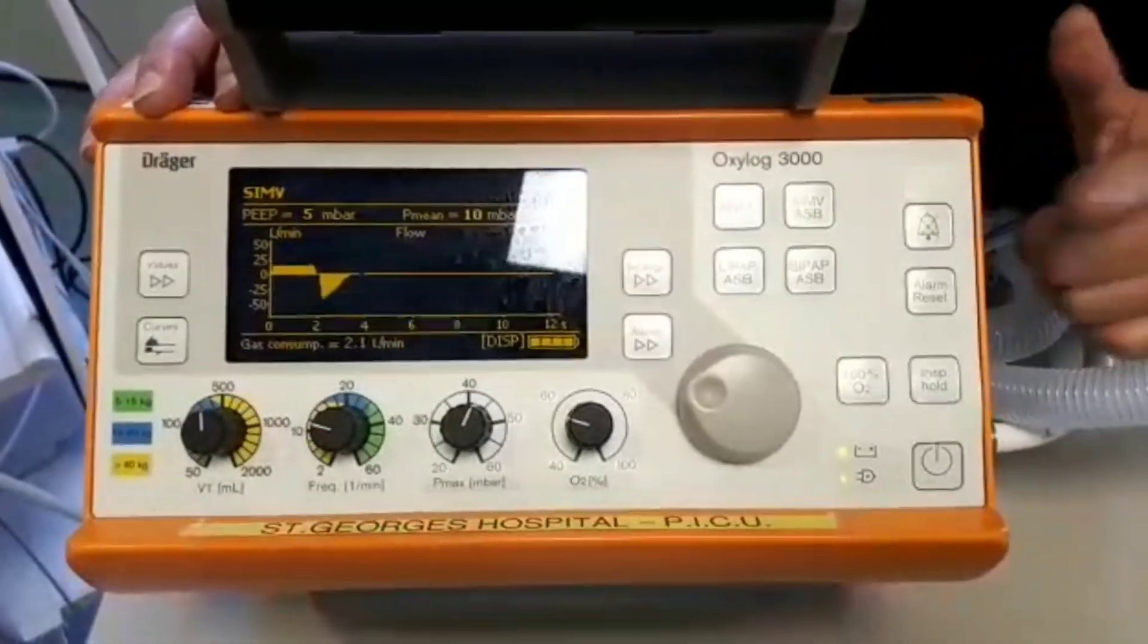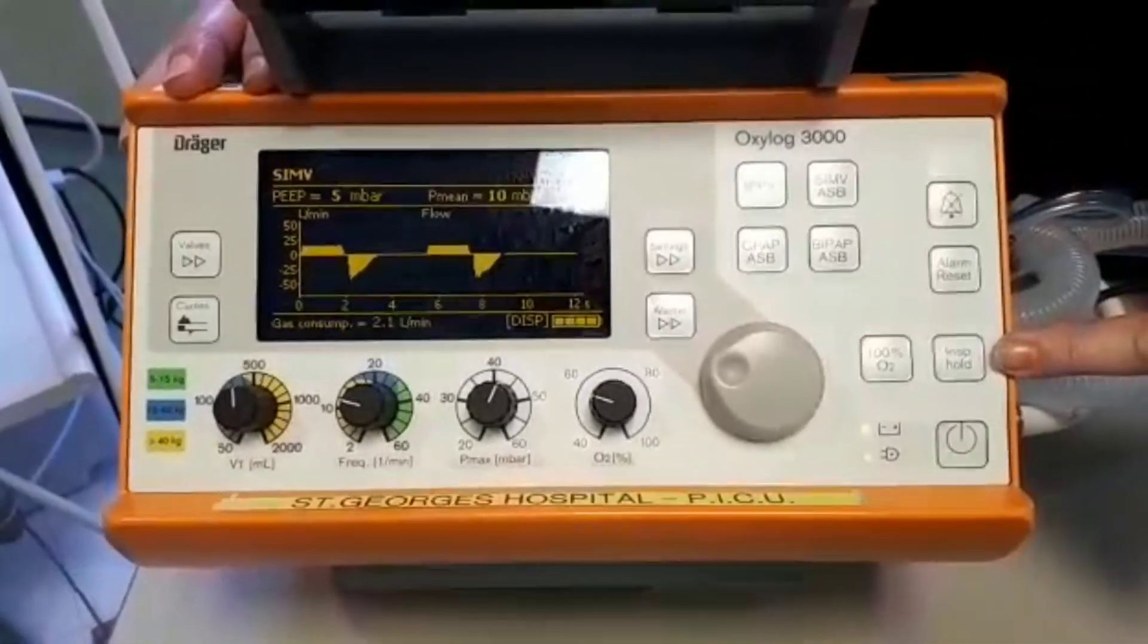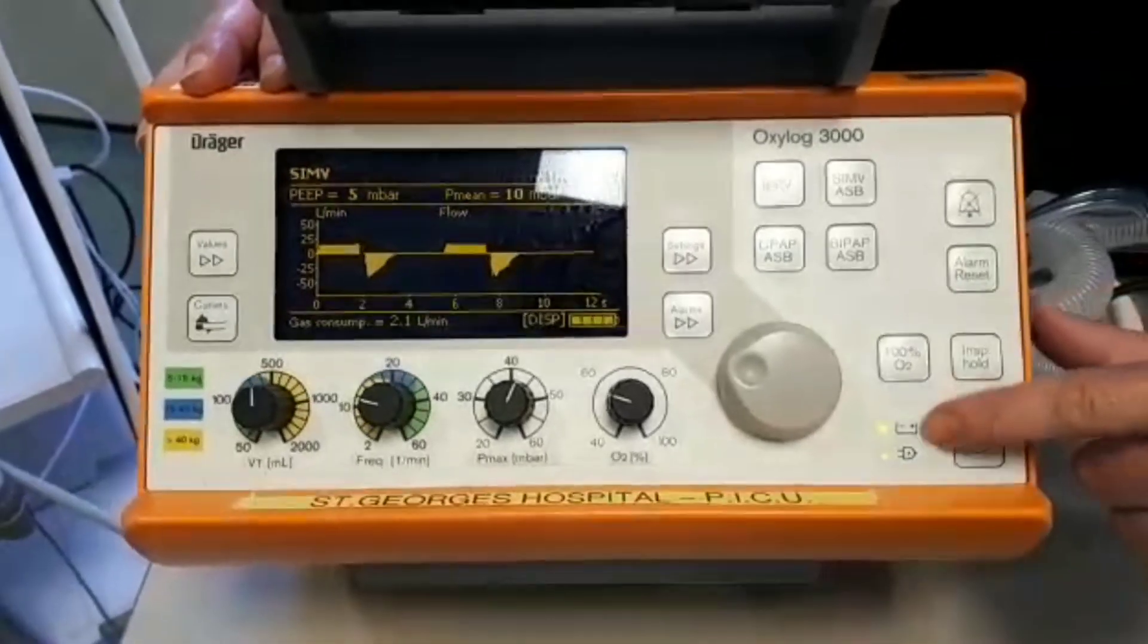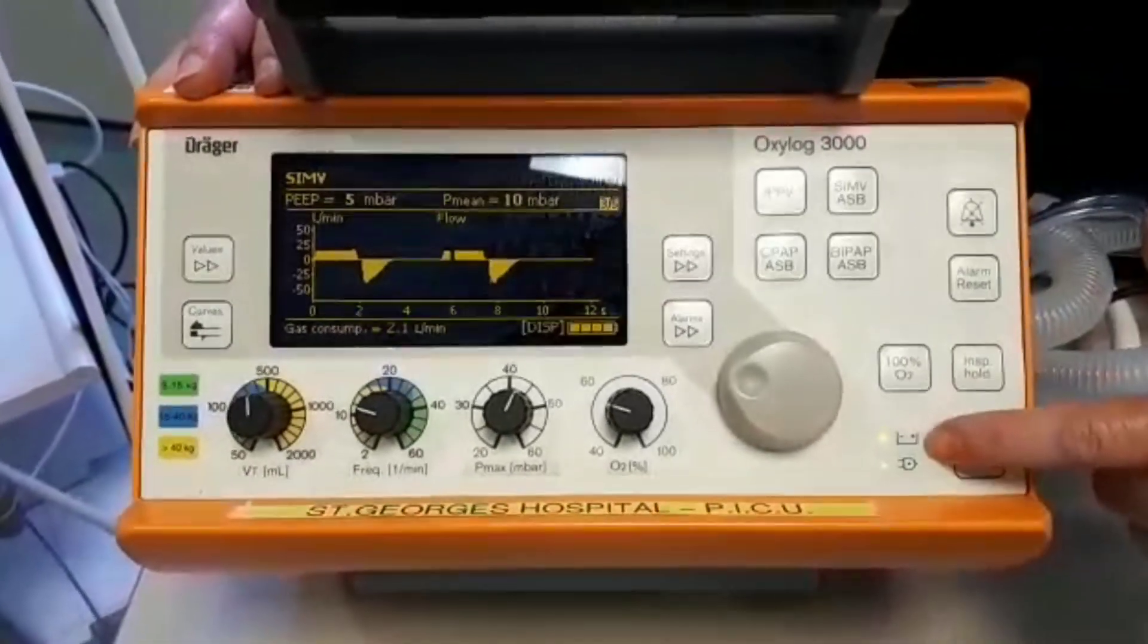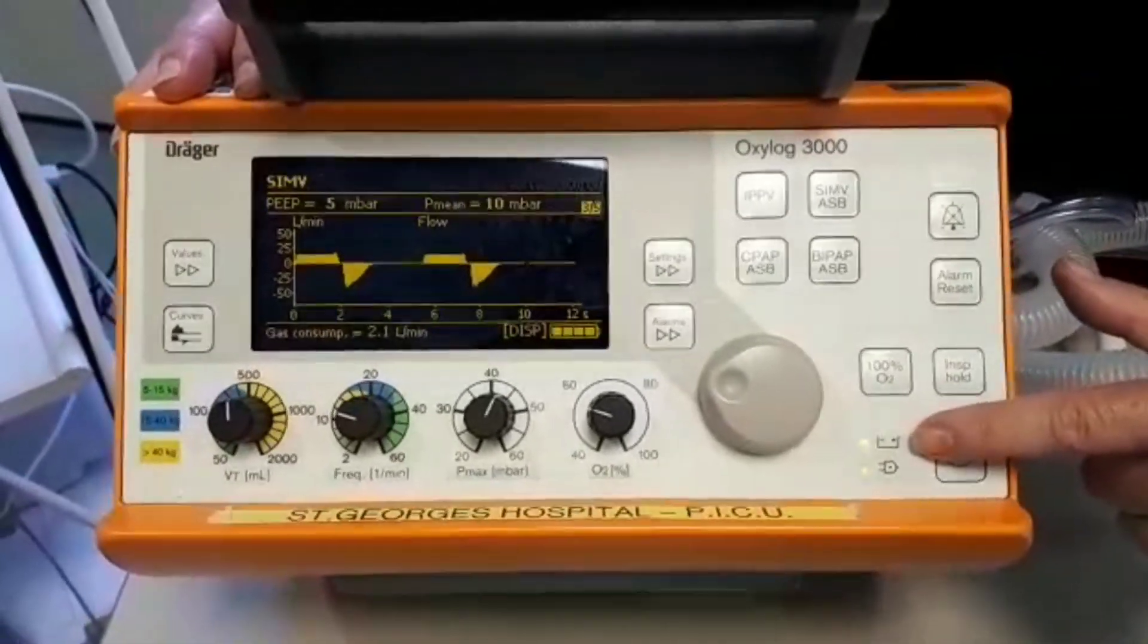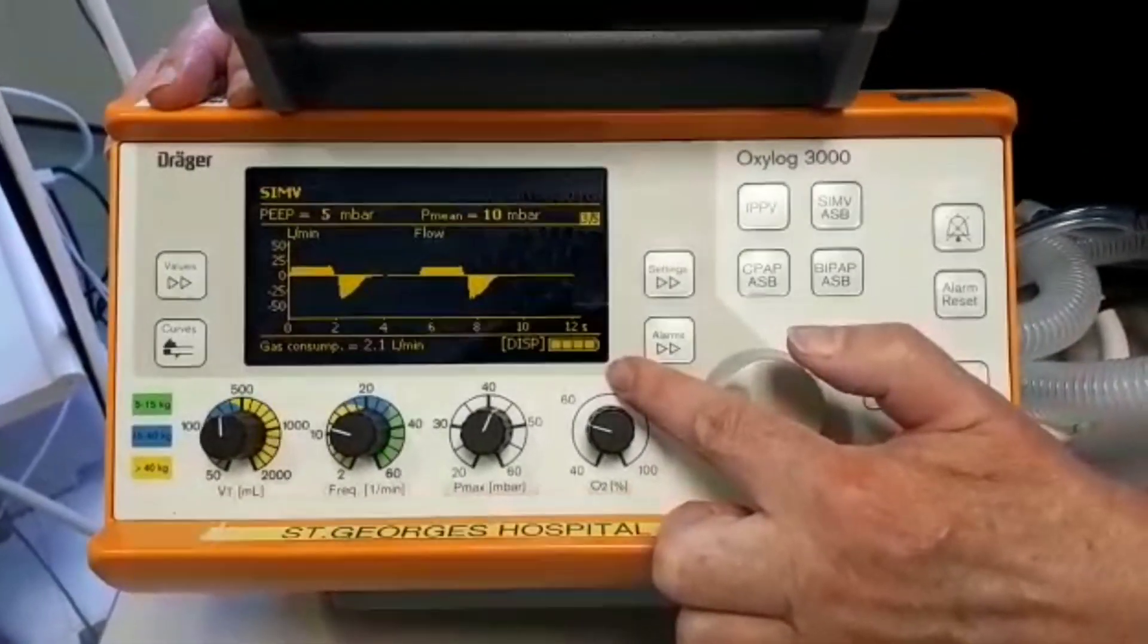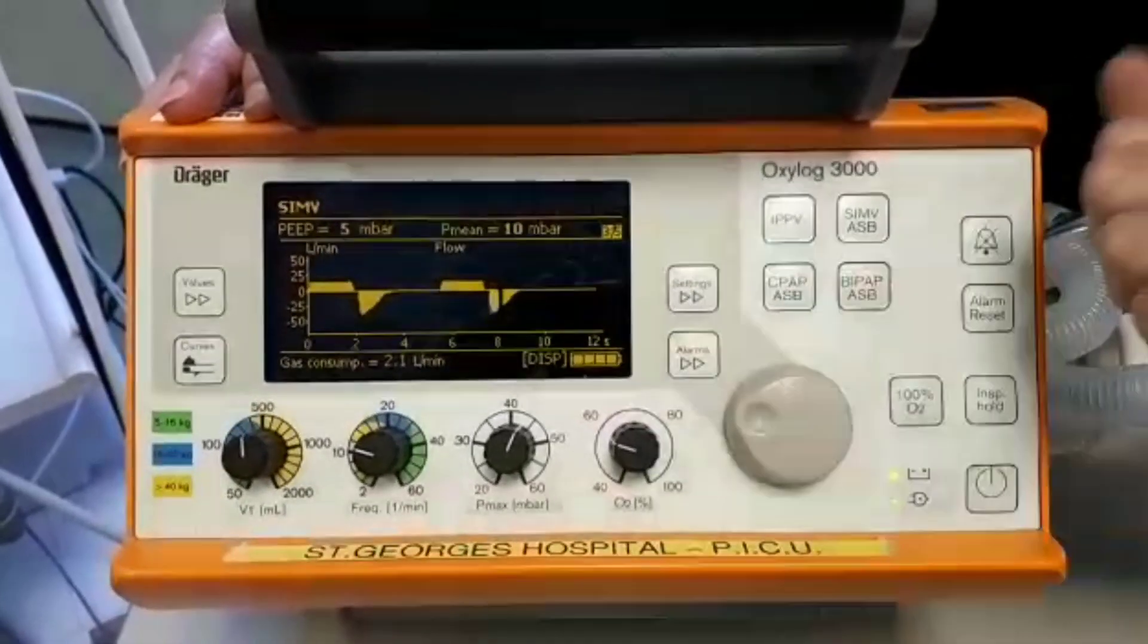Over here we have our alarm silence, our alarm reset, inspiratory hold, and a hundred percent oxygen. We also have down here our mains and battery indicator. As you can see, they're both green, it's connected to AC mains, and the battery is fully charged. We also have a further battery indication at the bottom of the screen with the battery display showing the charge there.